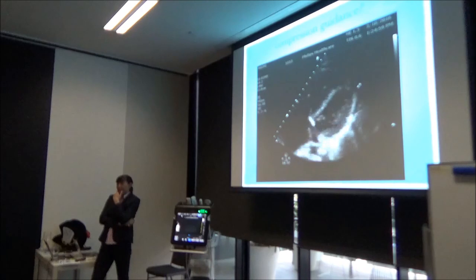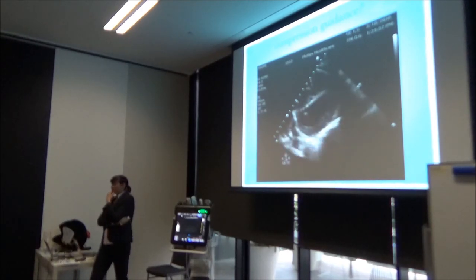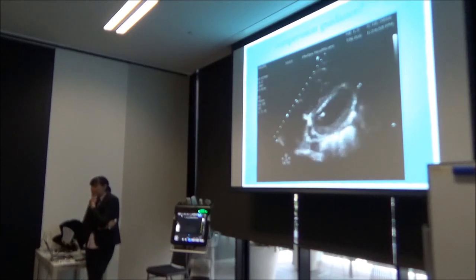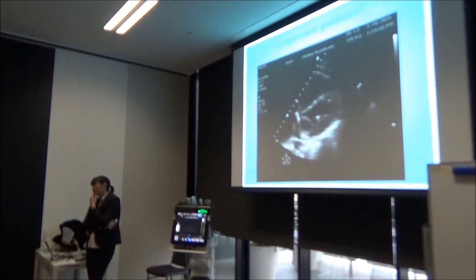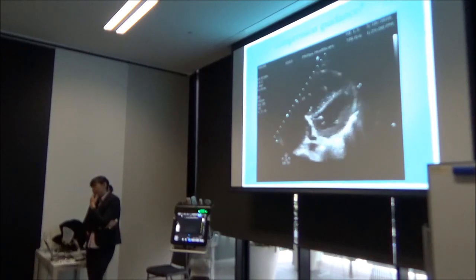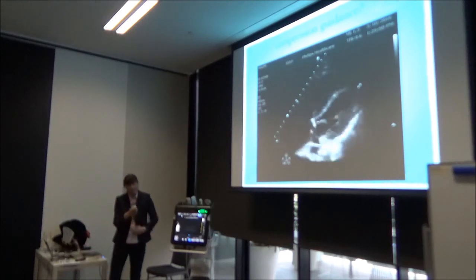Okay, so this is the really cool stuff. What do you think about the CPR? We do not teach this routinely in our echo courses, and I think we should start. Good, bad? You only have a 50-50 shot here. The ventricle doesn't squeeze.